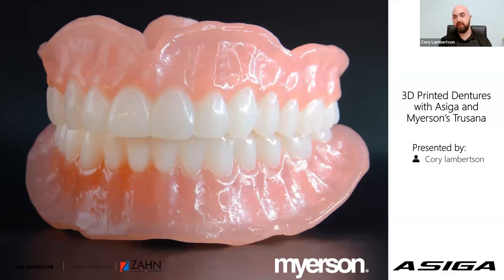Thank you, Fran. I appreciate the introduction. Hello and welcome, everybody. My name is Corey Lambertson. I'm the GM of the Americas for Asiga, and today we're going to be taking a look at the workflow for the Myerson denture resins and how they tie in with Asiga. Before we get started, I do have a quick video I'd like to show, so hopefully everybody can hear the sound well.